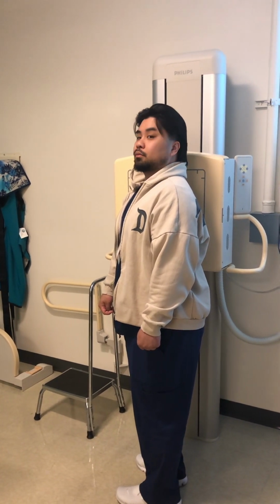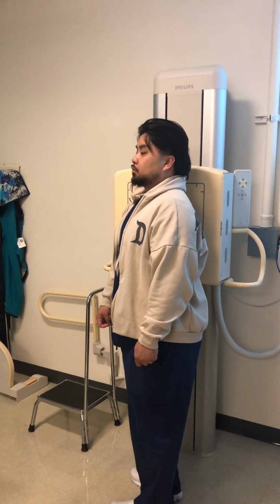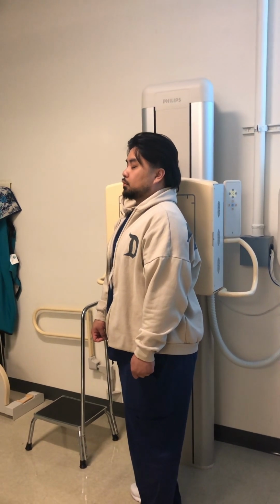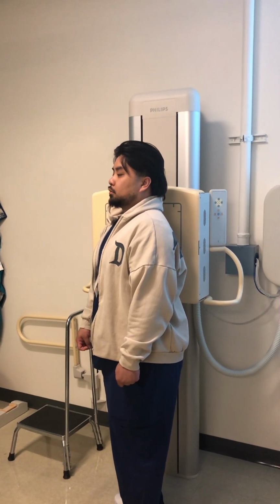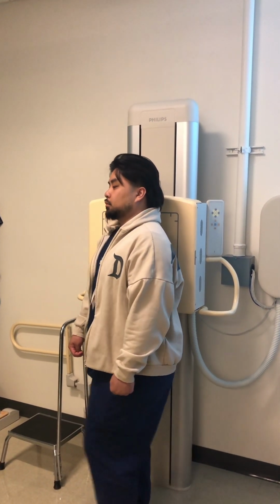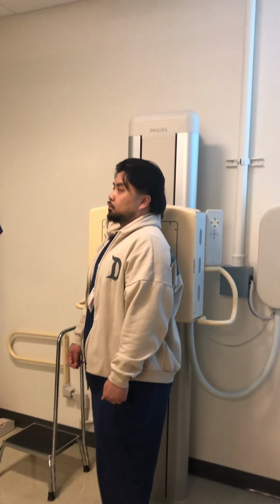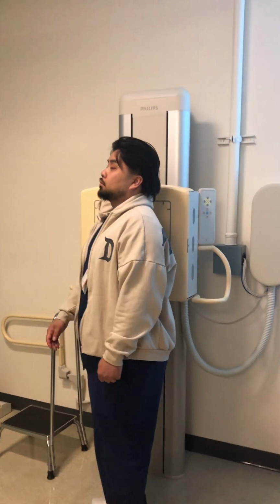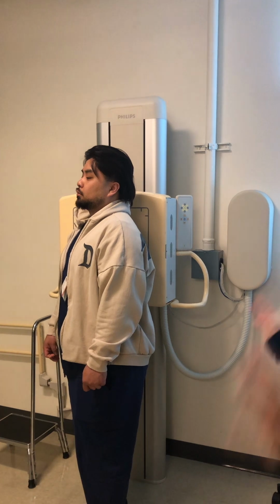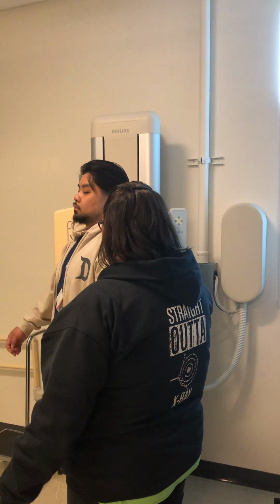Typically, would you do this bilaterally for the routine? Depends on the protocol. Some sites only want the side of entry. So like I said, I fell on my back, tripped over something, landed on my child's toy, jabbed me just under my scapula, hurt deep in the ribs. Sometimes it is just that side. Other times they're like, let's get the other side for comparison just in case. So then you would be doing a bilateral AP and then an RPO and an LPO. But that depends.